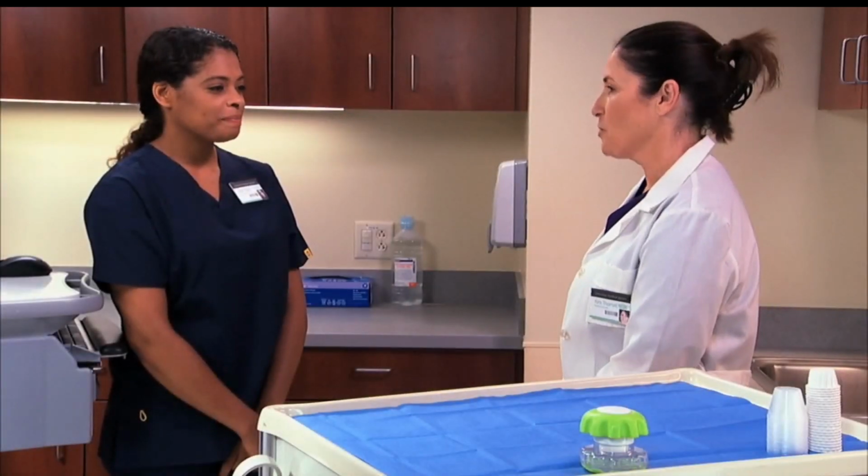So what can you tell me about your patient, Talia? He had oral surgery for tongue cancer, so he has a gastrostomy tube for supplemental feeding, to help him consume sufficient nutrition. Right. It's also very difficult for him to swallow his medication because of mouth ulcerations related to chemotherapy. So we're using the gastrostomy tube for medications as well. Then you'll use liquid medications whenever possible.